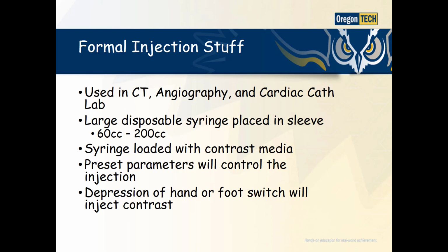And then this is going to be started up with the depression of a hand or foot switch, or it can actually interface with your imaging equipment so that it's just part of the system there. If it's a hand or foot switch, it is a dead man switch. In other words, if you let up on the button, the injection will terminate at that time.